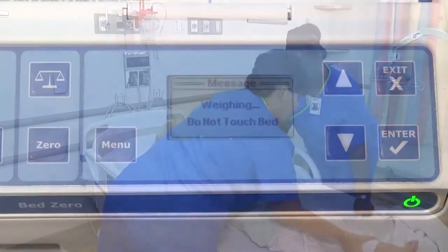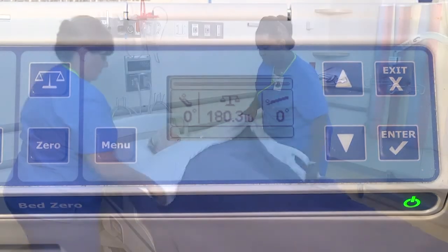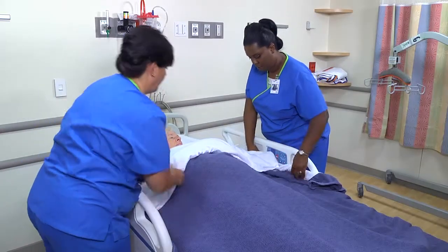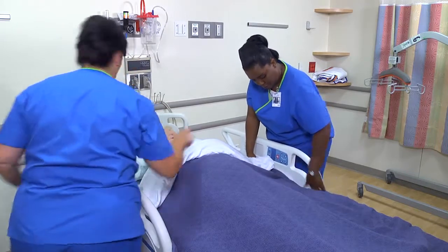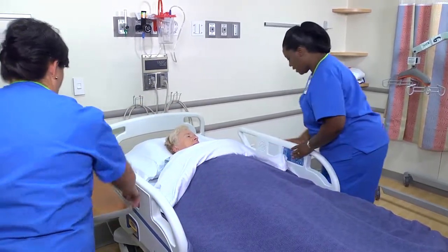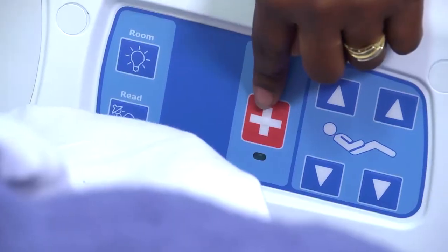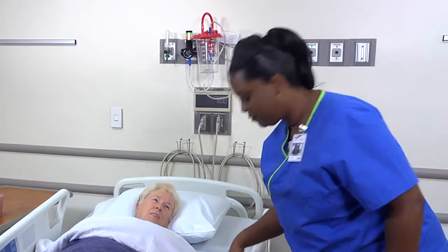Some hospital beds have scales built into the center. These scales allow you to obtain a weight with the patient in the bed. No matter which method you use, compare the patient's current height and weight with his or her previous measurements. Ms. Wilder, we'll be back to check on you, but if you need me, there's the call light.